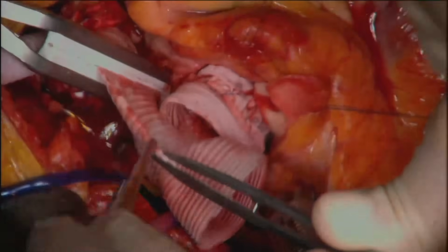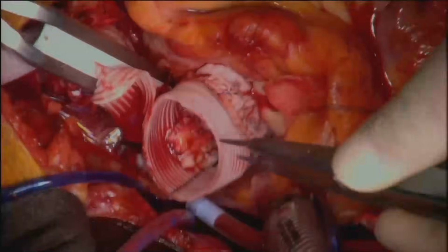The distal and proximal grafts were trimmed to the appropriate size.